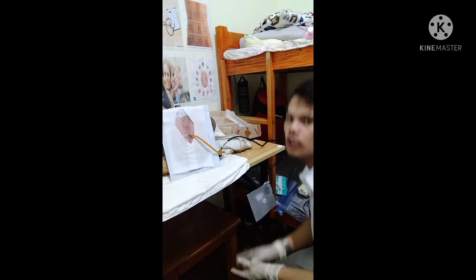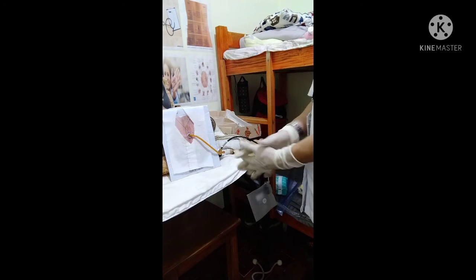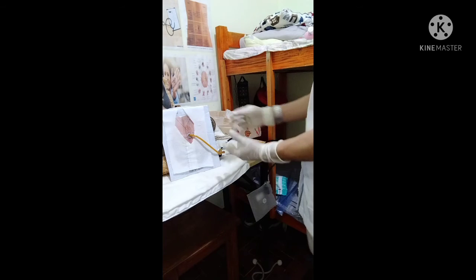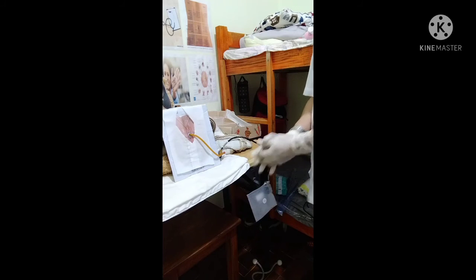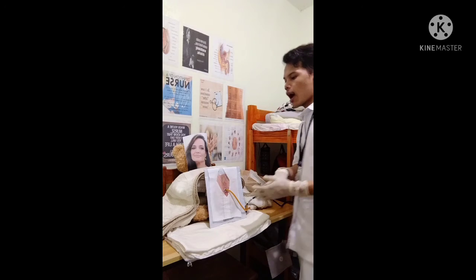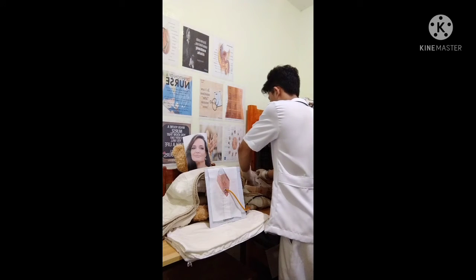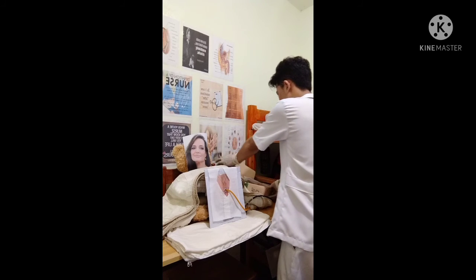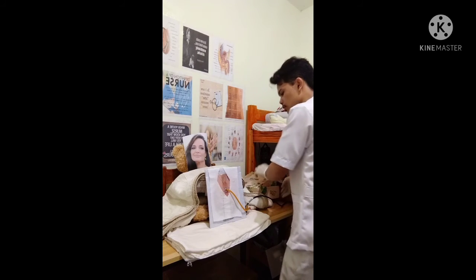So after that we need to place our patient in a comfortable position. So of course it promotes the patient's comfort. Now we need to do the aftercare. Of course we need to clean the materials that we've used thoroughly and immediately after doing the procedure.